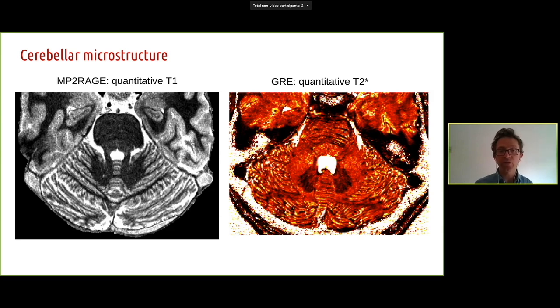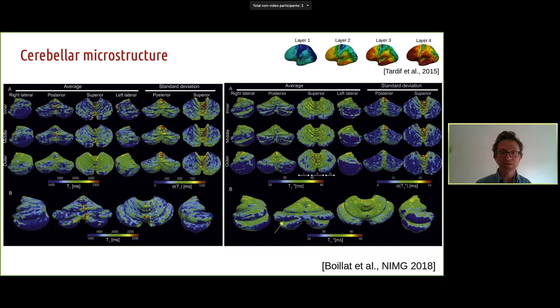Whereas if you look in the surface, like we did here, you can start seeing a few different things happening, looking from inner to middle to outer cortical boundaries, and looking at T1 and T2 star patterns, respectively, here, left and right. You can start seeing some separations that look like bands on the T1, and also quite strongly in the T2 star, you can see very strong separation of the upper and lower regions.